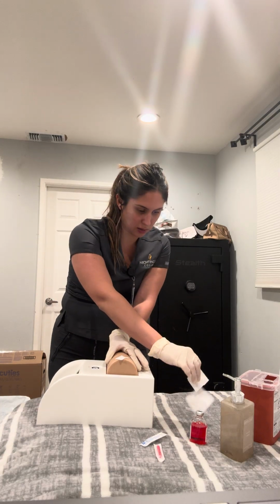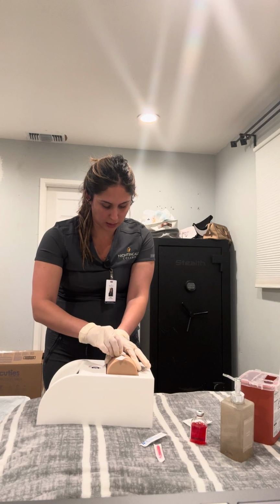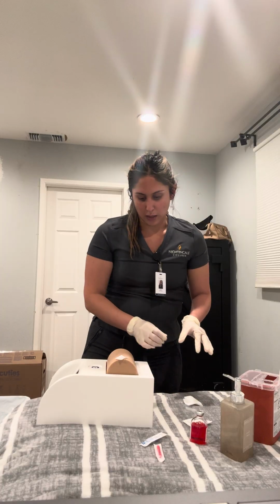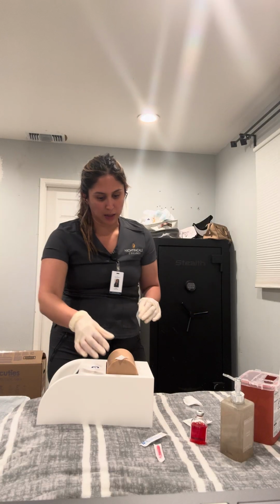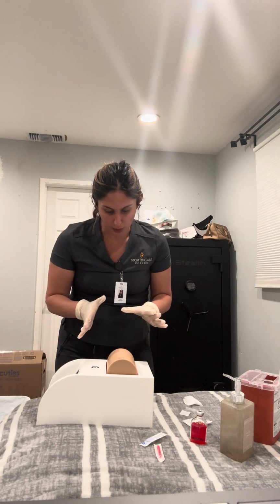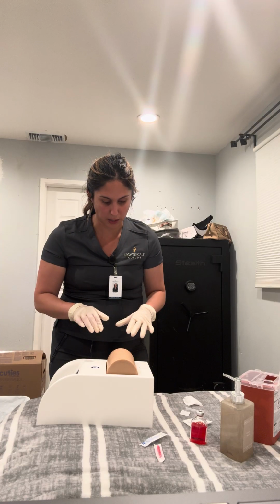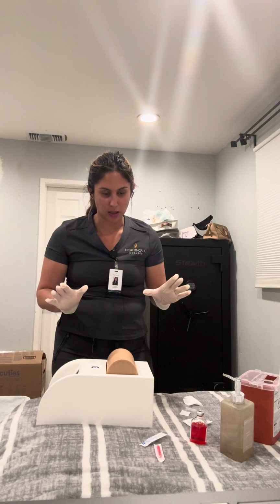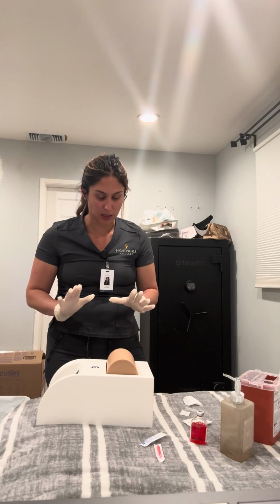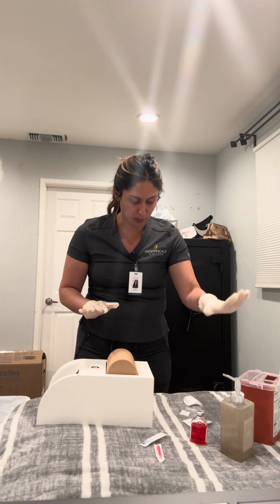Then I'm going to observe the patient and make sure that they're not bleeding. If they're bleeding, you would just slightly dab. I'm not going to be massaging the area. When I picked this injection site, I made sure that there was no redness, no swelling, no indications of pain, no signs of infection or anything wrong with the skin or the integrity of the skin. Once I'm done with the shot, I put the syringe over there.